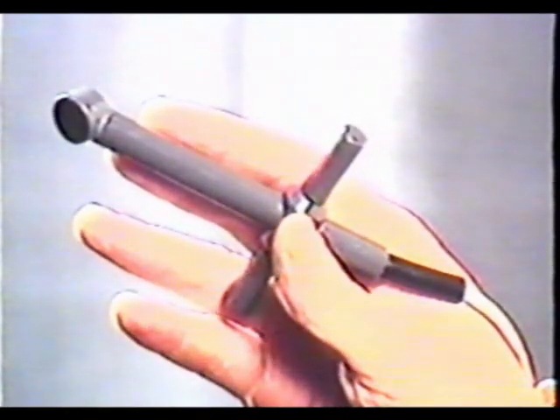Having completed the pulsed wave exam, we will proceed with a continuous wave examination. Because it usually yields a crisper velocity spectrum, we prefer to use the small, non-imaging transducer for the continuous wave examination. We reserve the duplex continuous wave probe for situations where it is necessary to verify the source of a Doppler signal.